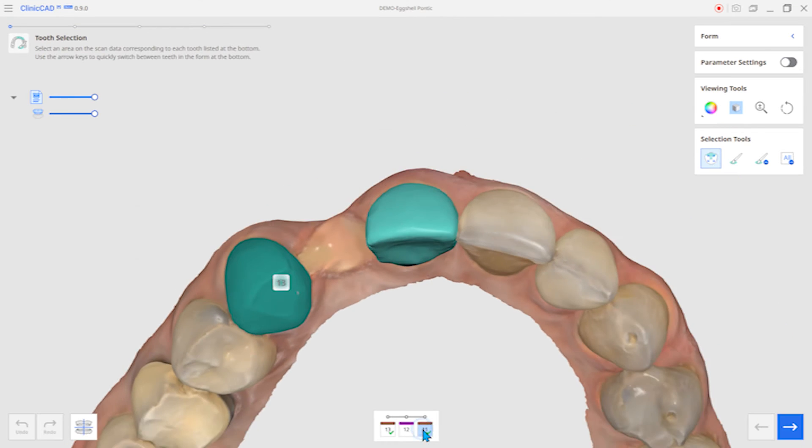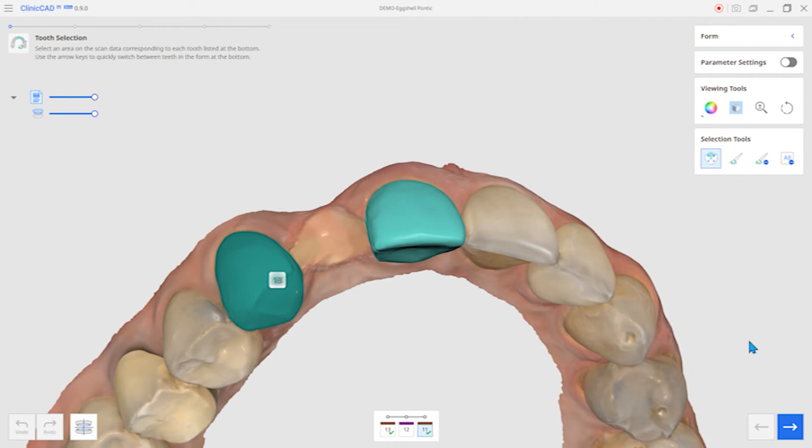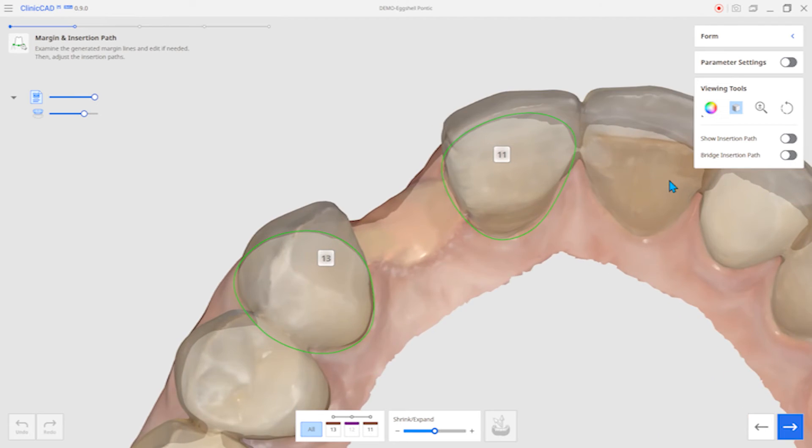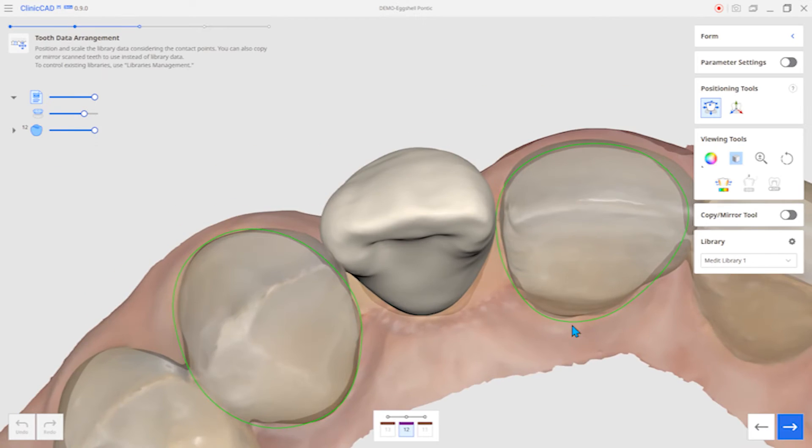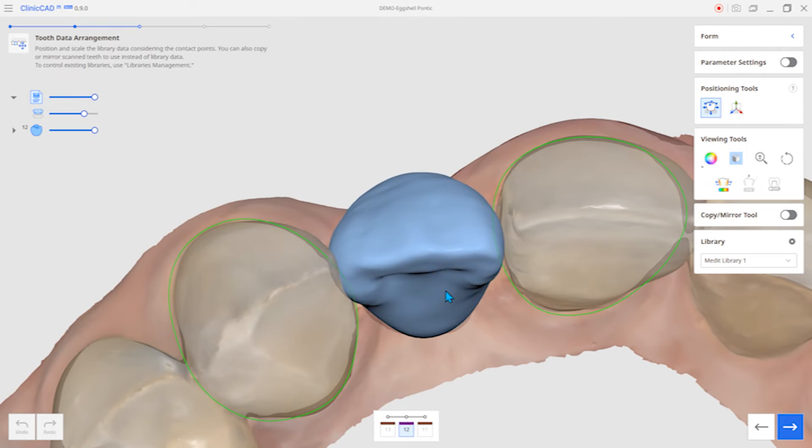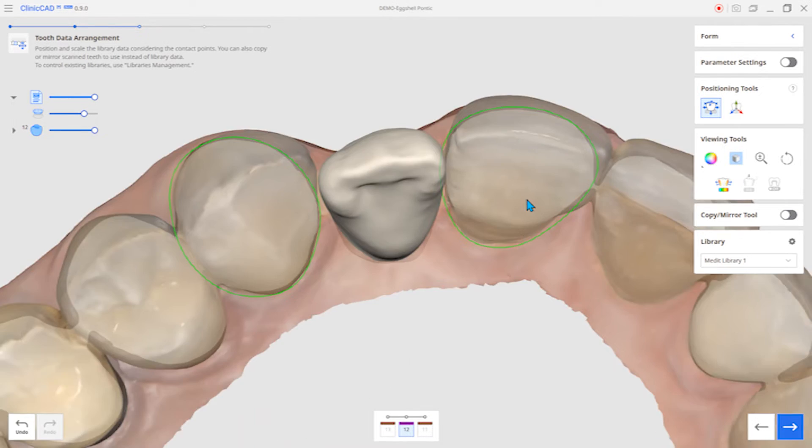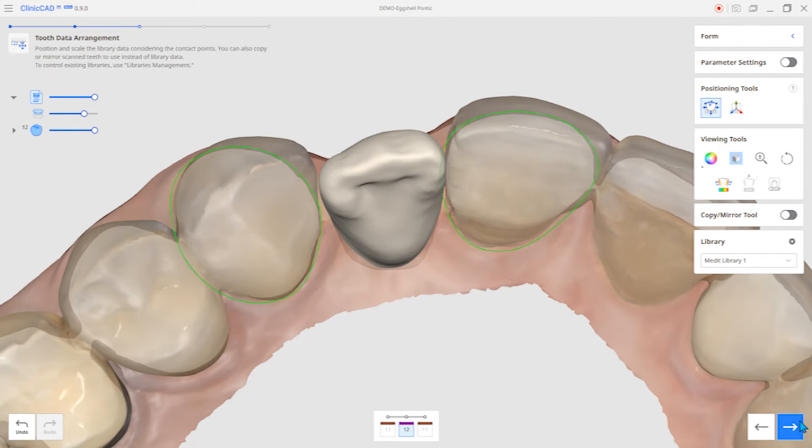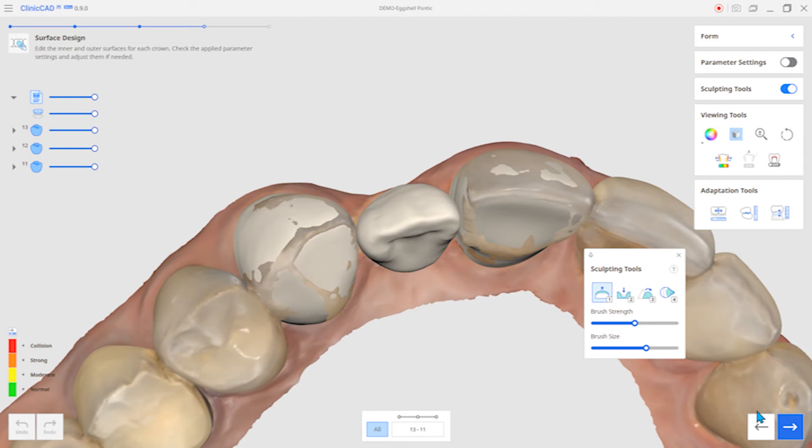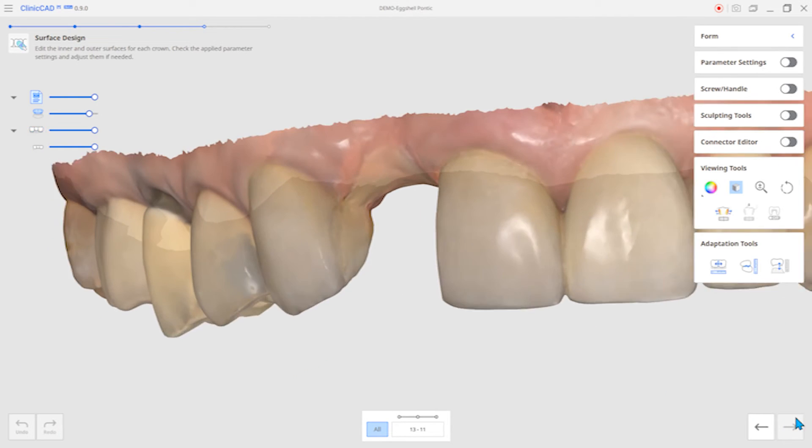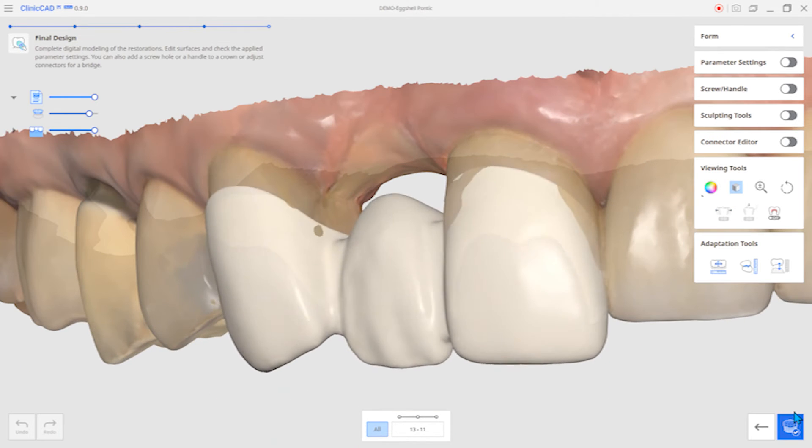The next feature is the Eggshell Pontic Library add-on. When there's a missing tooth, an eggshell bridge can be made by using the Pontic Library.